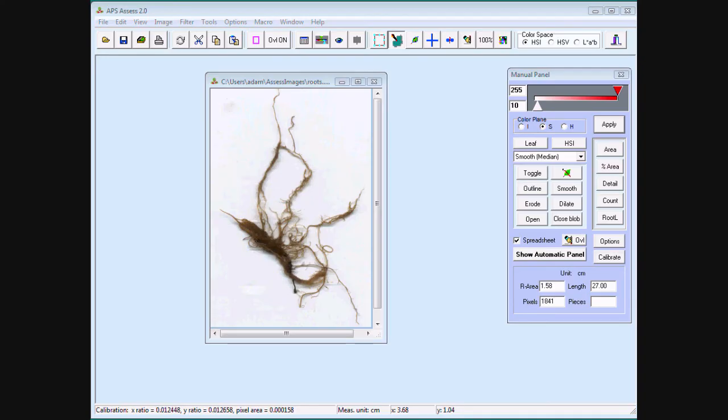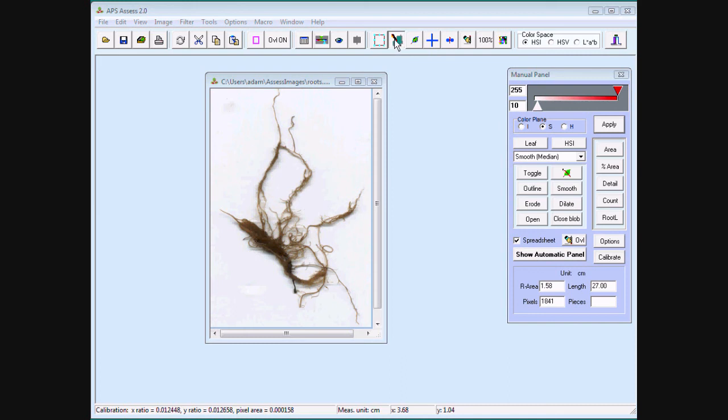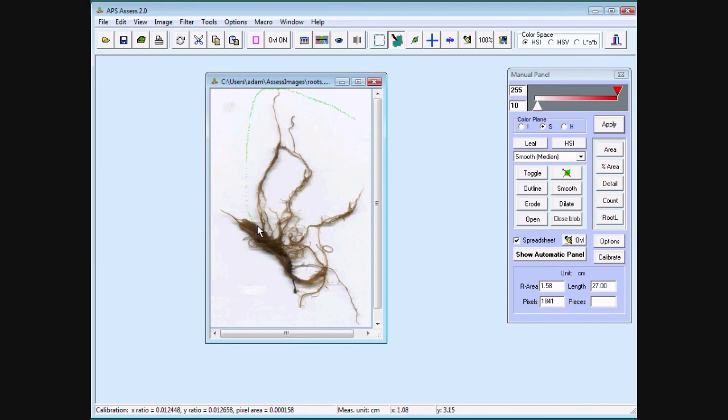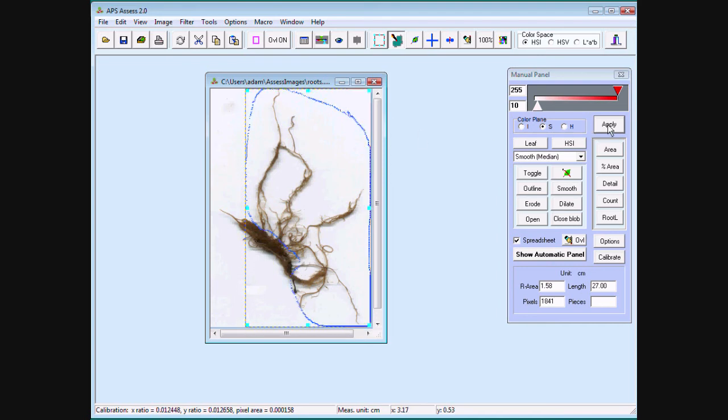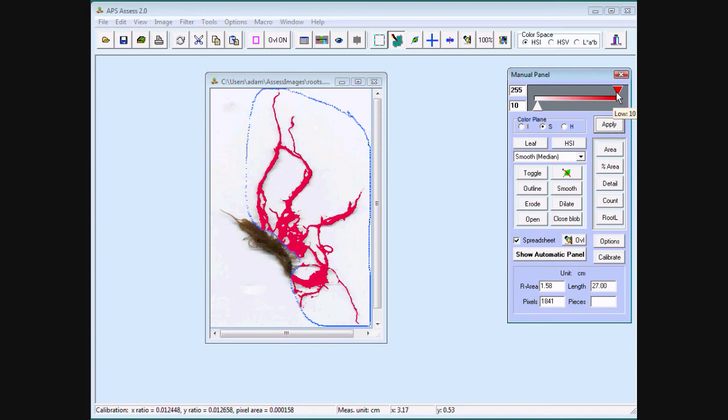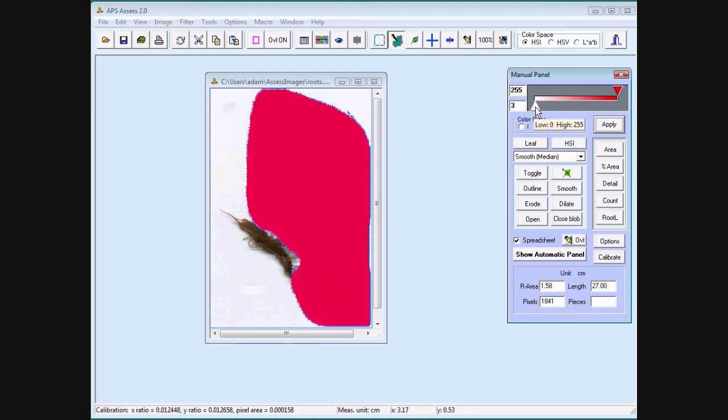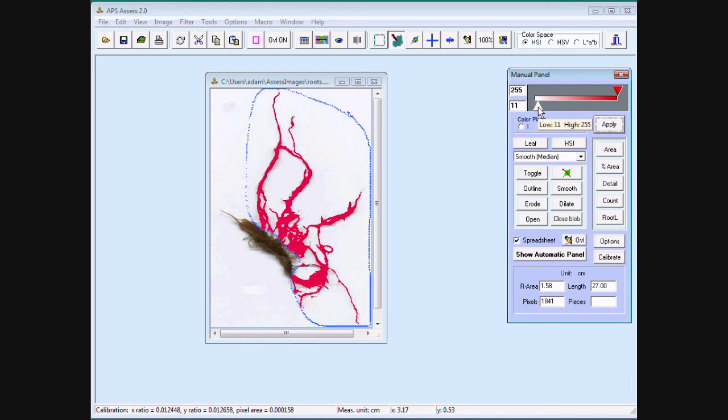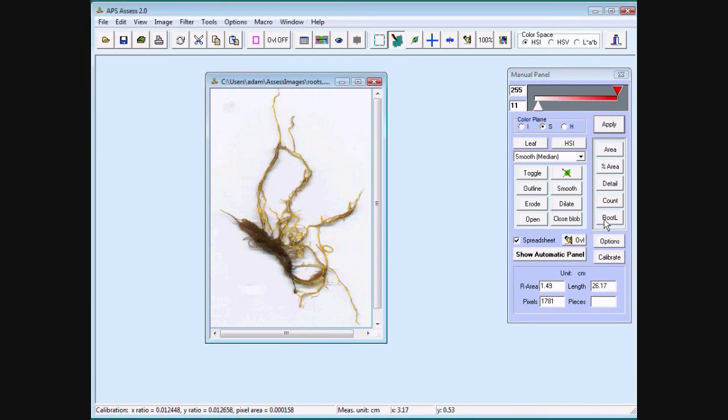Assess can also calculate root length. Use the manual panel, HSI, and saturation. Mark the free form area of interest. Threshold saturation and click root length. Root area 1.49 centimeters, length 26.17.